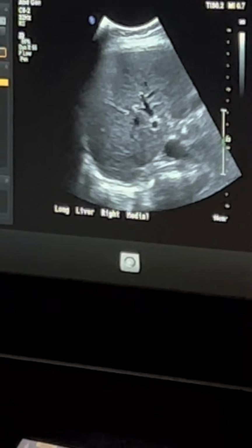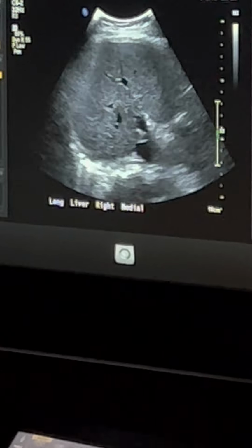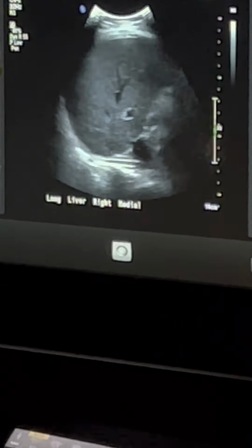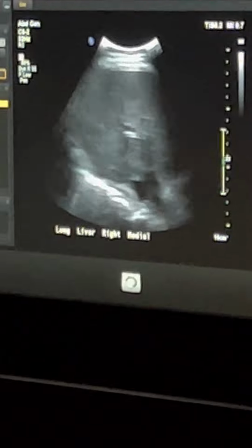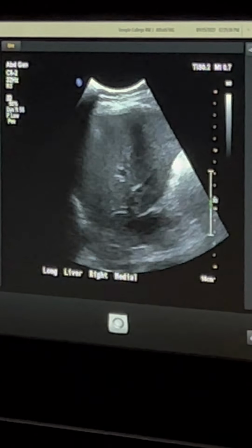Contact loss and rib shadow are gonna be two of the biggest things that you struggle with. So gel and extra pictures pretty much is what you're gonna have to do. If you take one picture where I can see the edge of it here, but I can't see this, then you're gonna slide over and look, now in between that space. Same thing. Get in between that space, see it better. But you're gonna take a couple of different ones, okay? So when you hear us say build your pictures, that's what we mean.